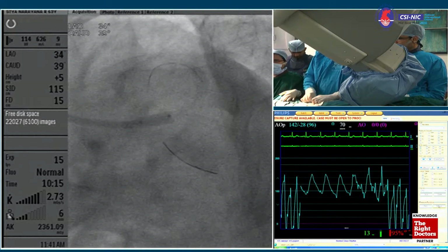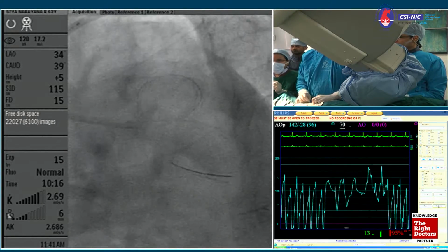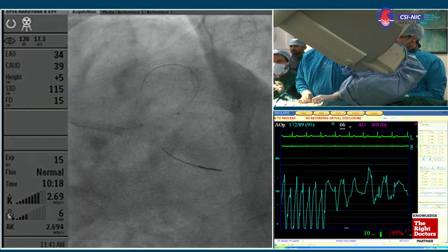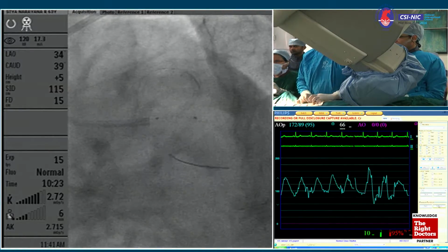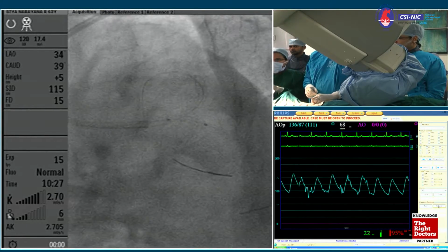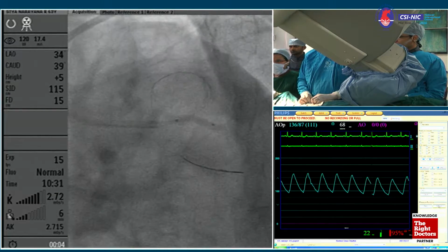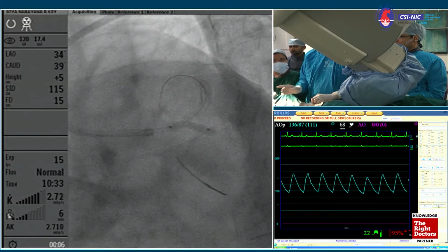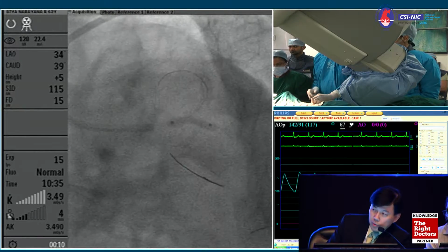Any comments from the panelists? Yeah, I think planning to leave LAD completely unattended, if you go from left main to circumflex stenting and leave the ostium of the LAD as it is without any stent, then chances of this coming back is even higher. Well, the IVUS study tells us that 90% of distal left main has got some kind of ostial LAD involvement. Yeah, we can see then. We will take a picture and see, but the ostium LAD is already looking not normal after the stent.